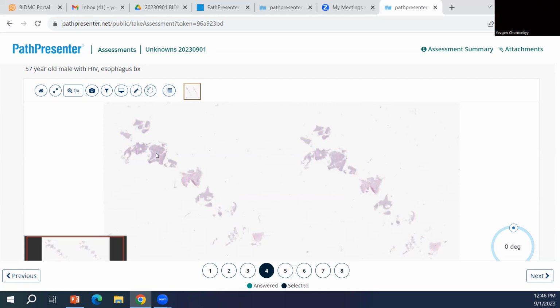Really? Oh my God. Do you know from outside places if it's better? Because I agree, usually I'll just see it on H&E. And if I don't, the stains are negative. Maybe it's different in the skin and the esophagus. I've never randomly ordered an HSV and found it positive. I've always seen it when it's there.